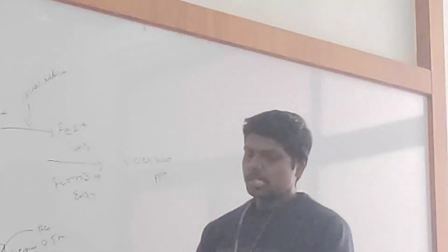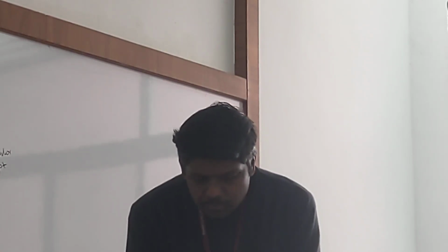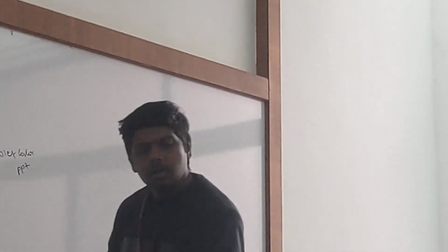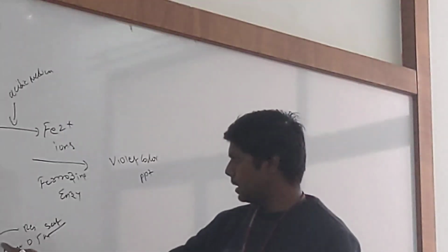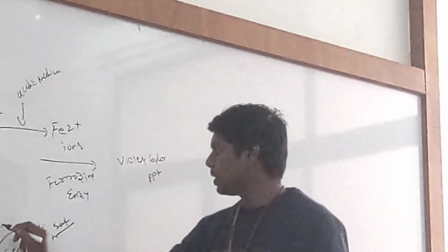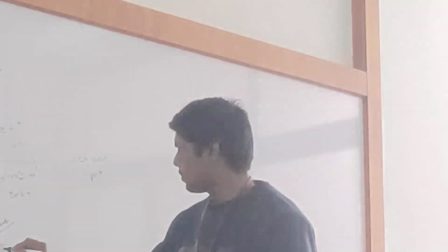We will add excessive iron molecules to get the total iron binding capacity. Mix well. There is another reagent, the saturating reagent. We got a precipitate in the serum. Serum has excessive iron molecules. Then to it we added this reagent, and then we waited for 10 minutes.